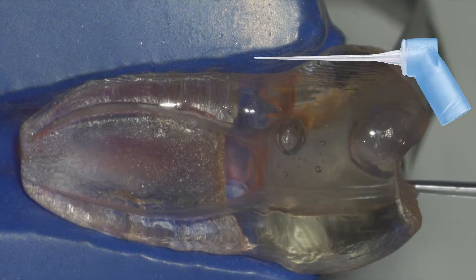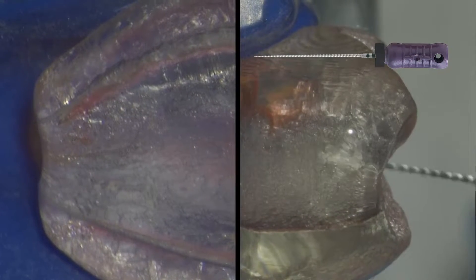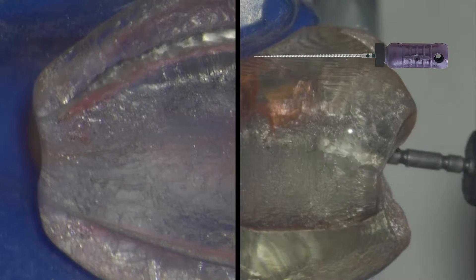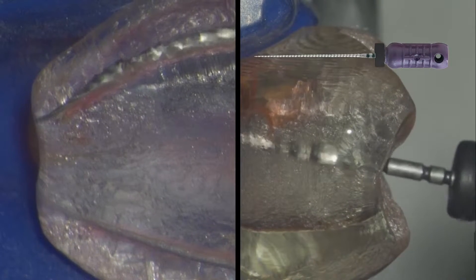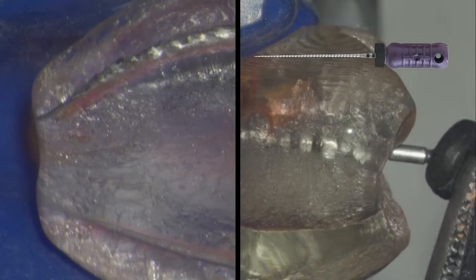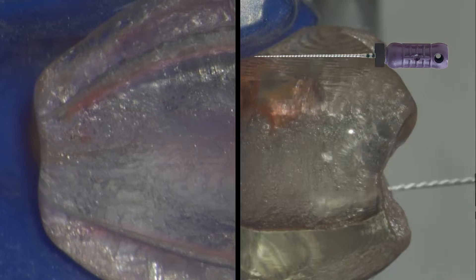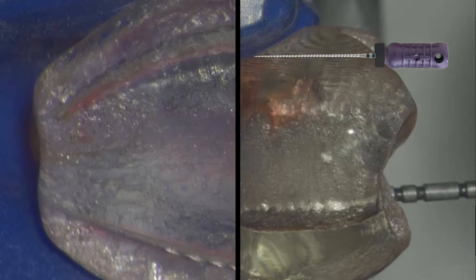Remember, you want to make sure you rinse the chamber and irrigate the canal before going to obtain your working length. Once we've completed our coronal modification, we rinse the chamber, irrigate the canal, and then obtain our working length.